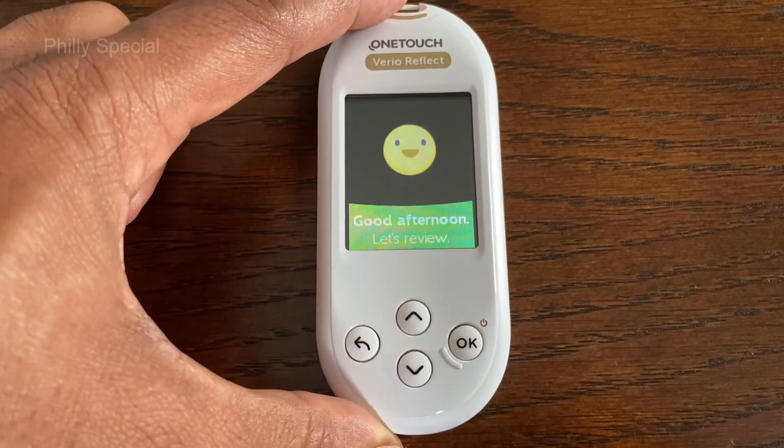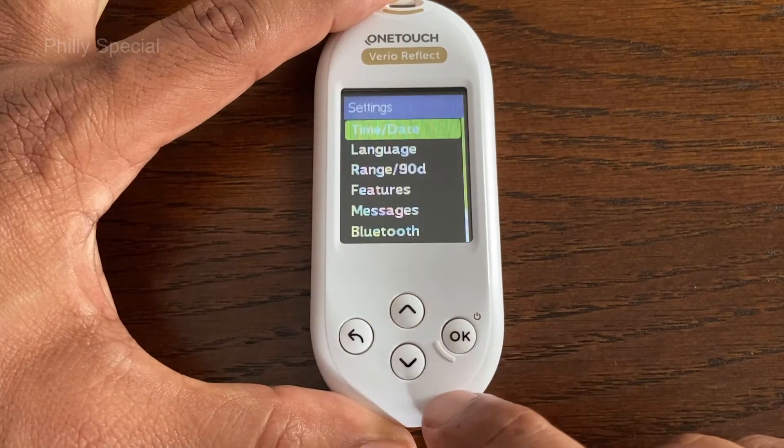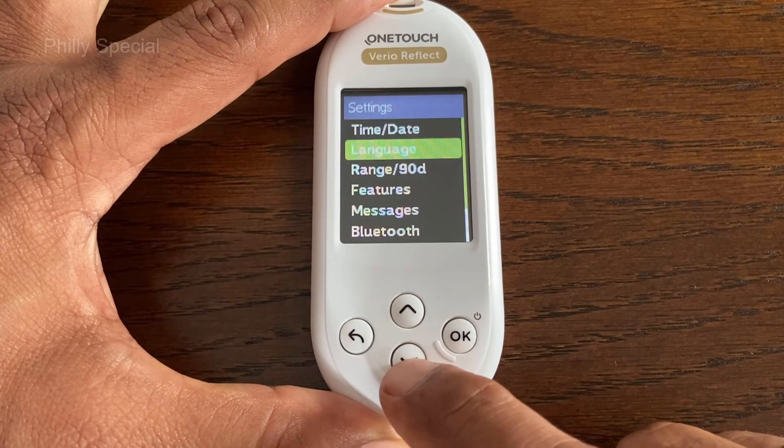Press and hold the OK button to turn the meter on. Once the meter is on, use the arrow button to scroll down to the Settings option and press OK to enter Settings.